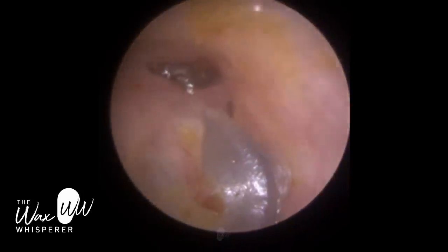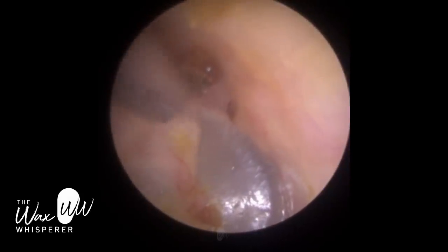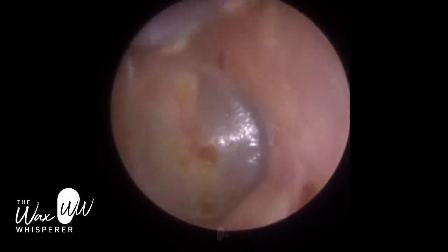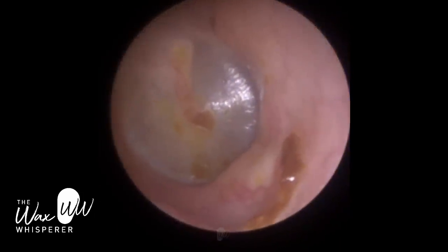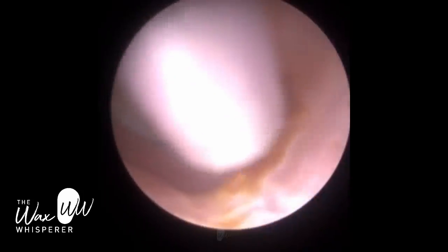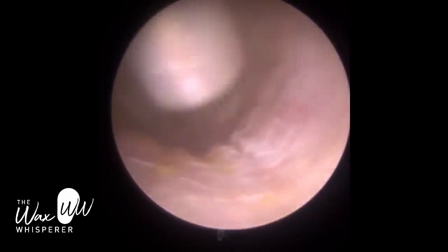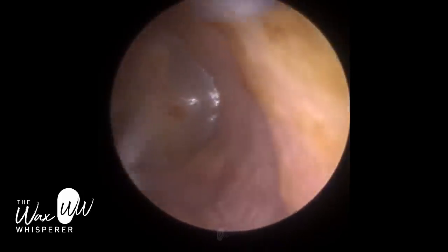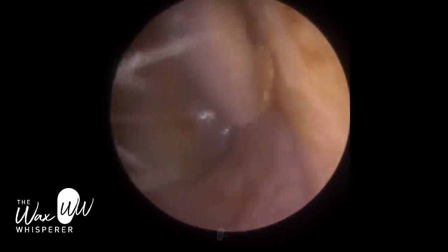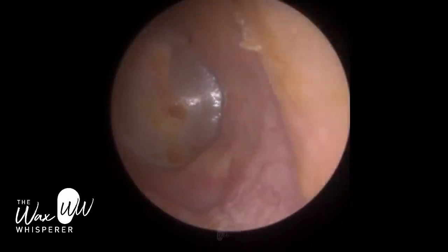There's a bit of wax on the roof of the ear canal, so I've attached a fine end tip again just to mop this up. The patient is very still. There's also some wax at the base of the ear canal — there's a bit of a trench here where the ear canal dips inwards, narrows, then protrudes back outwards and narrows again. We're mopping up right near the entrance now, which we can identify by the hair strands — always located on the outer part of the ear canal, normally the outer centimeter. Hair follicles don't grow through the bone; they only grow through the cartilage.